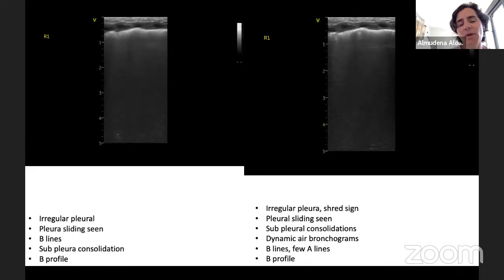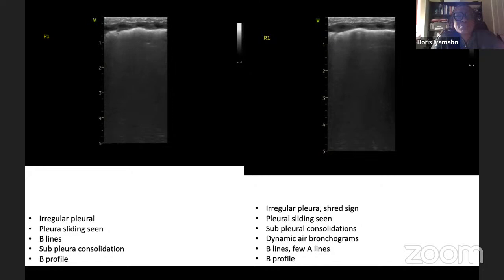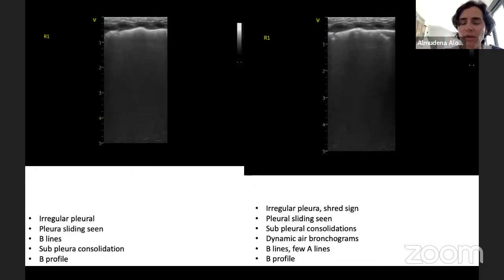What these images are telling you is that probably you have ruled out complications, because you are really intubating the baby because you think that maybe there's something that may seem worse. You see that there doesn't seem to be a pneumonia. Nosocomial pneumonia can be ruled out with these images, at least in these areas. Probably what you can understand from these images, which we're going to review in the talk we will be having today, is that maybe this infant's not ready to be extubated, because you're still seeing a completely white lung, at least in these areas. You can rule out pneumothorax, pneumonia, and atelectasis due to position.